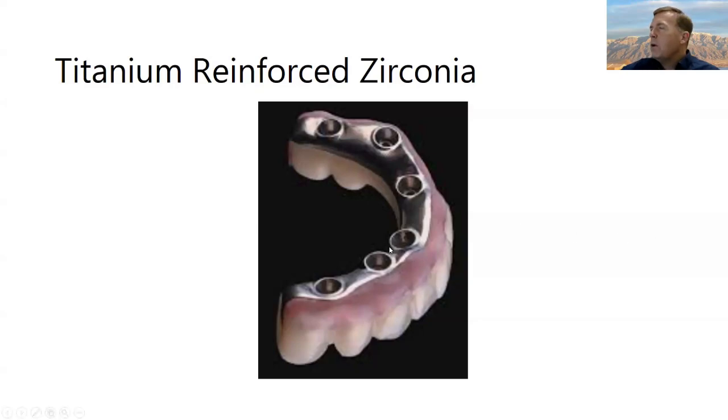The one thing you have to watch out for with this is that the implant positions need to be pretty much perfect. If the implant positions are off a little bit, the definitive restoration with the bar in it may be a little bit thicker in those areas than the prototype was. You'll need to talk to your patient about that.